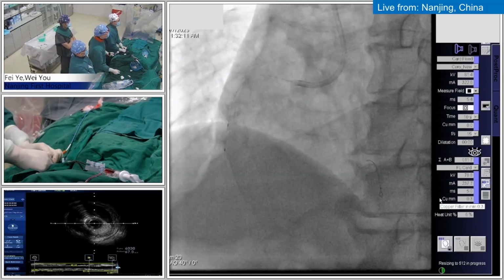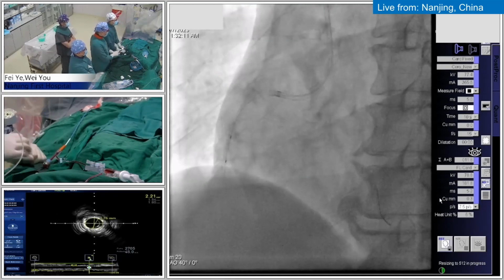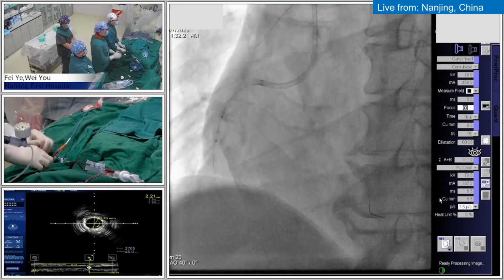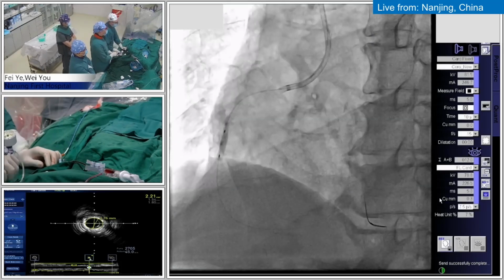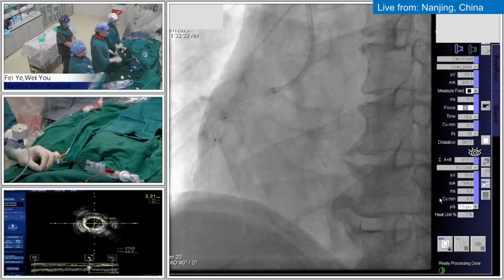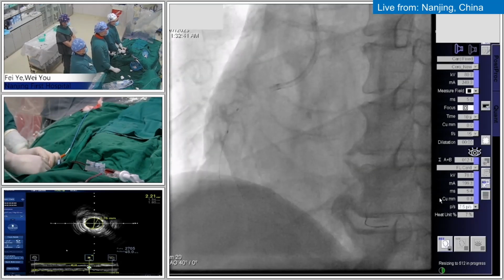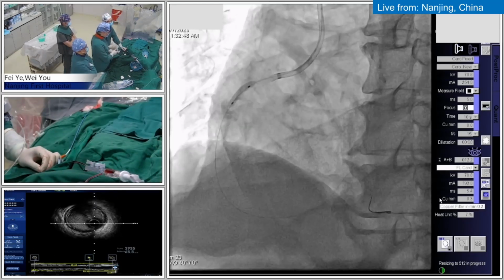Yeah, seems it works, Chief. This is a 22, 3.0 NC balloon. Okay. 12, 16. Okay, done. Yeah, it works. Go. 12, 16, 15. Okay, done. Go. 12, 16, 15. Okay, seems okay. Done. Okay, once more. 12, 15, 16. Okay, done.